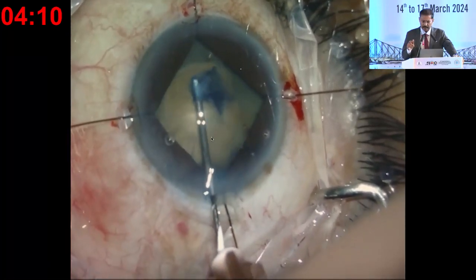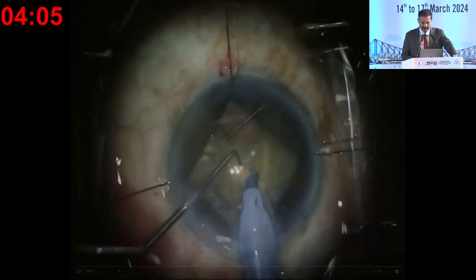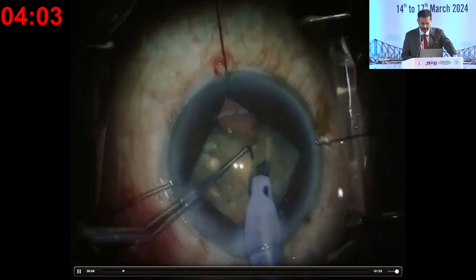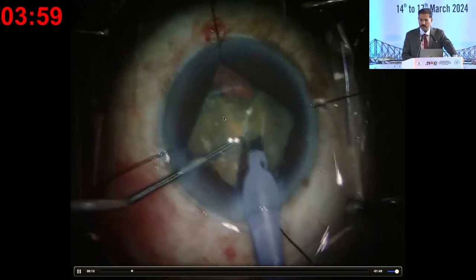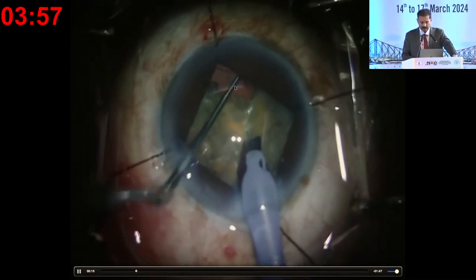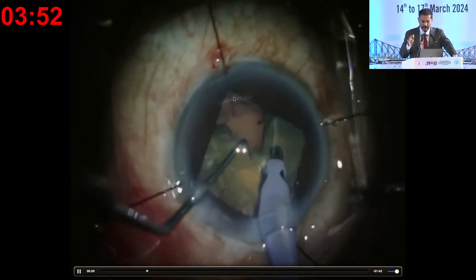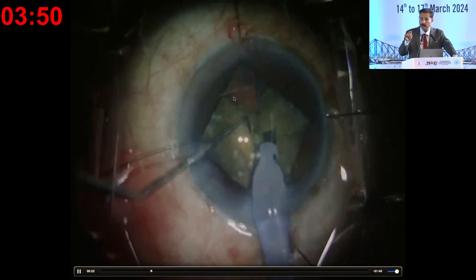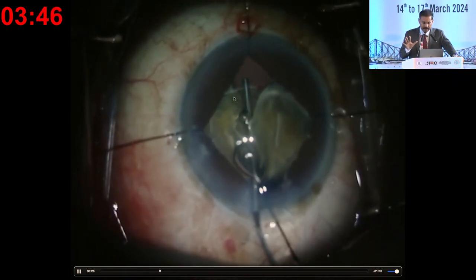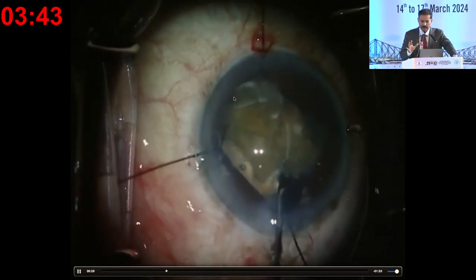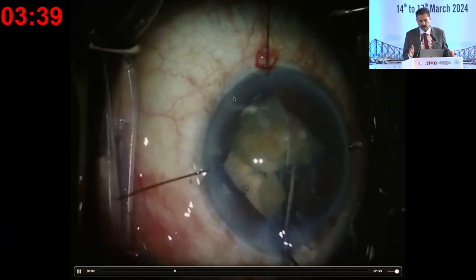Here again in a mature cataract, my rhexis is complete. I do my first chop. See the central white area there — I see something fluttering here. This is a very clear area; generally you don't see something like this. You'll have some vitreous. This line which I am touching — by touching it I can touch the posterior capsule. There is a large opening in the posterior capsule. The whole lens is there, divided into two definitely, but more pieces are still there. Here I would not want to continue with FACO.